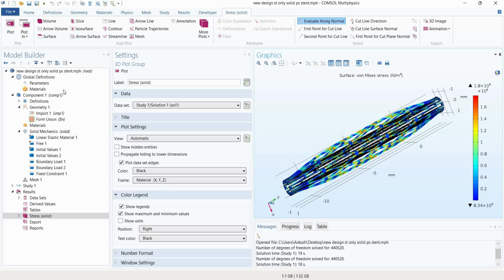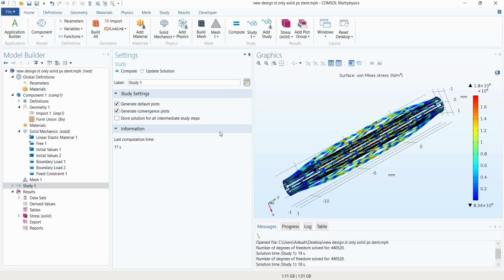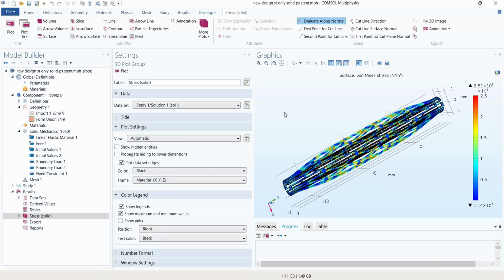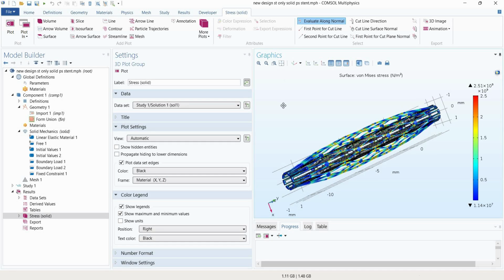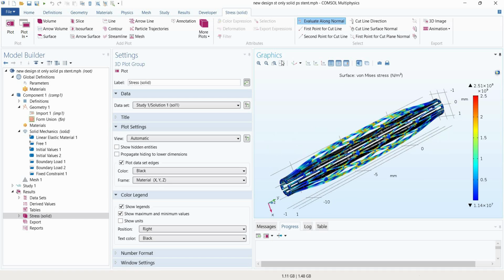Now we are going to perform it for 16 atm. For that we just change the value in the parameter. Type 16 atm here, then go to the study section and click on compute. It will take some time to compute. Now we got the von Mises stress plot for 16 atm inner load. The maximum value is 2.51 into 10 to the power 9 Newton per meter square.